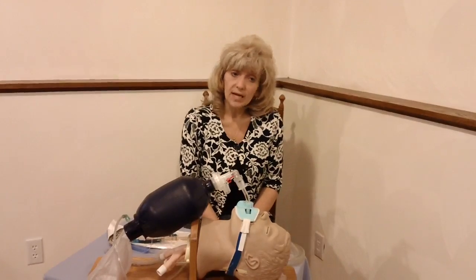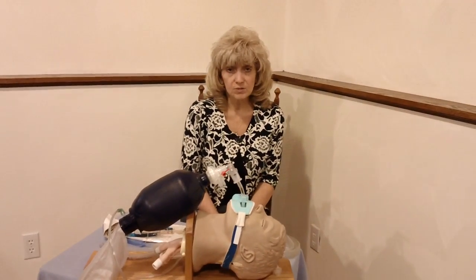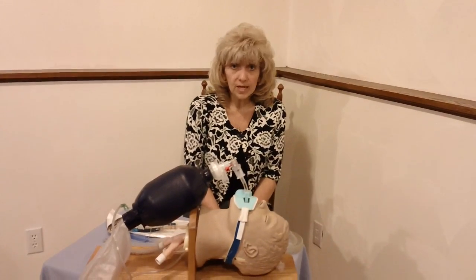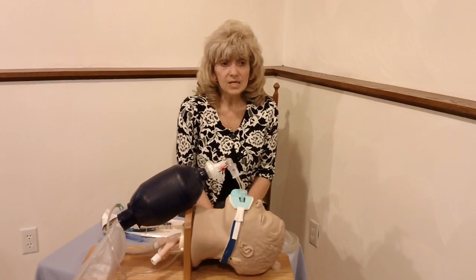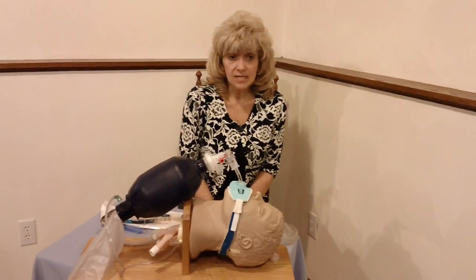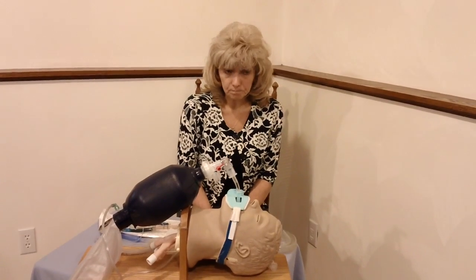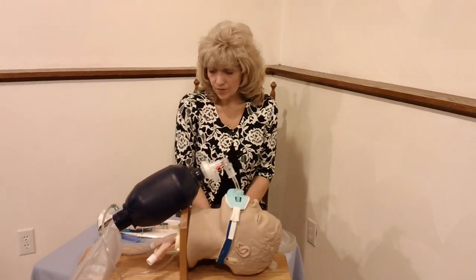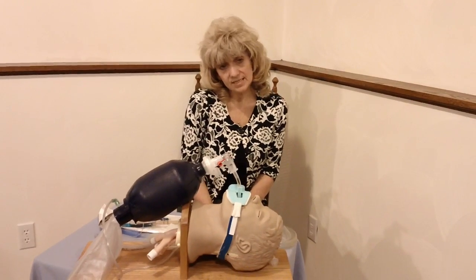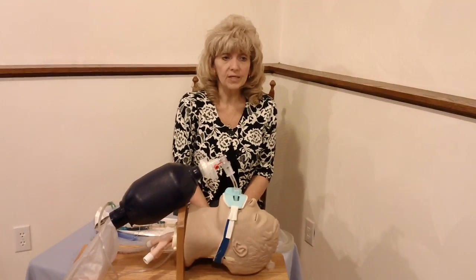The Macintosh blade is a curved blade, and primarily the size used for adults is between 3 and 4. The Miller blade primarily is used for children because it's a straight blade, and those sizes range anywhere from 0 to 4 as well. Oropharyngeal airways are the rigid airways that we use, as I said, to displace the tongue out of the way when we are preparing for intubation.